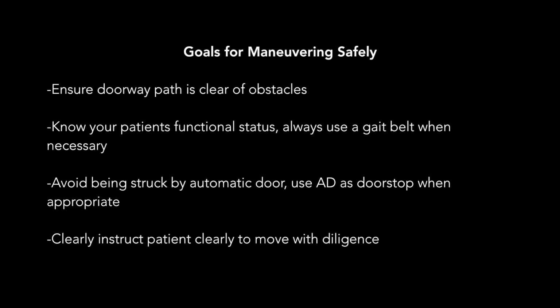Use the tips of the assistive device and swing the door wider than minimal to progress through the doorway. Lastly, always clearly instruct your patient to move with diligence, slowly, so as to maintain control of the assistive device and to maintain control of balance.